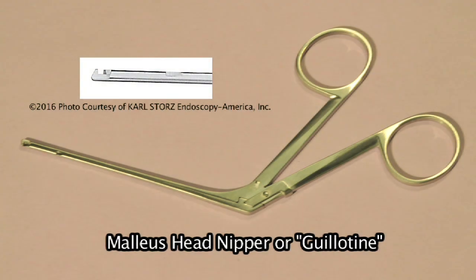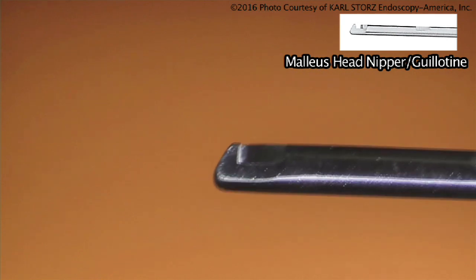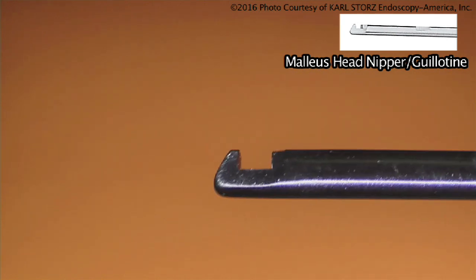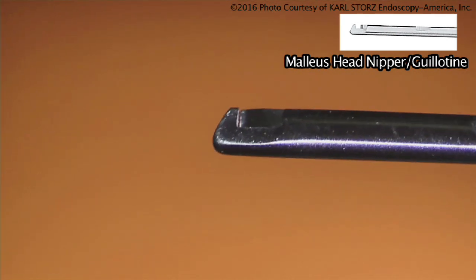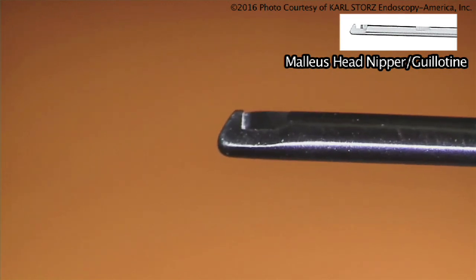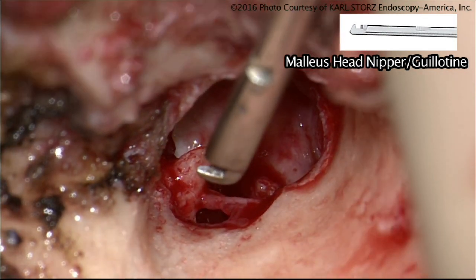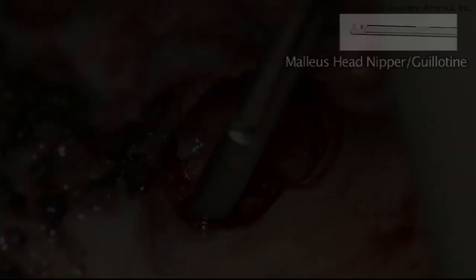The House-Dieter Malleus Nipper is used in cases where you want to amputate the malleus head. You place this beneath the neck of the malleus and close it. It's a fairly robust and sturdy instrument that will fracture the head of the malleus at the neck.